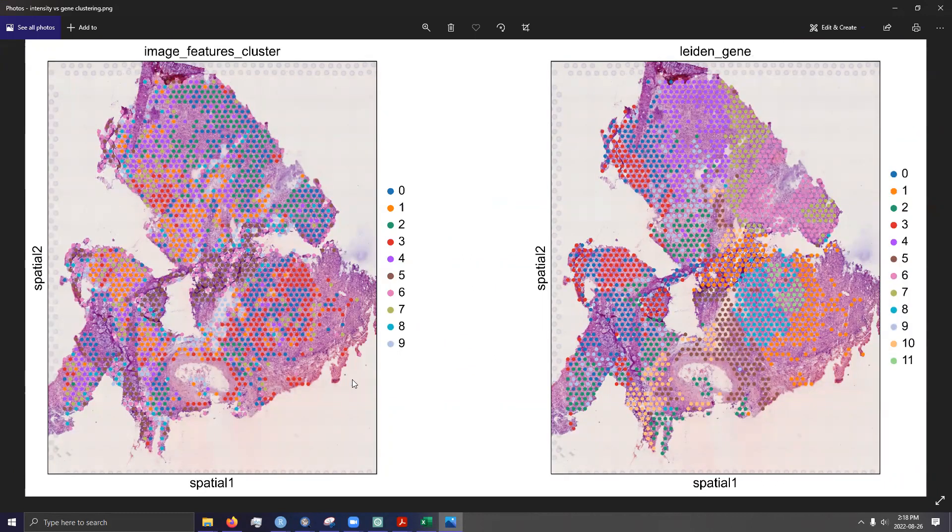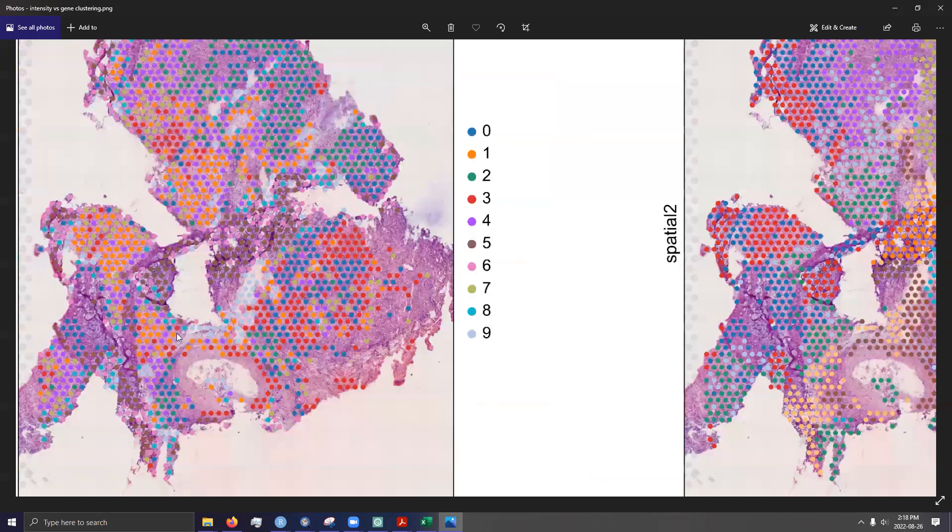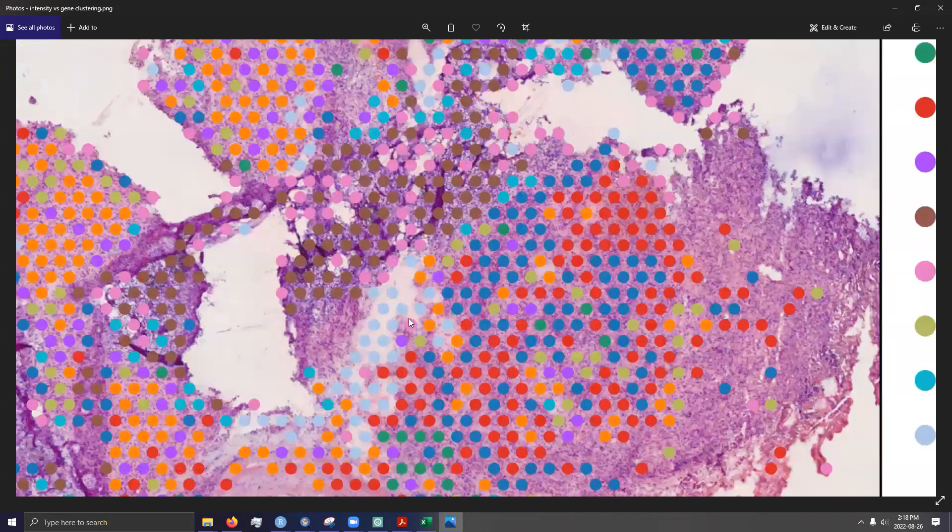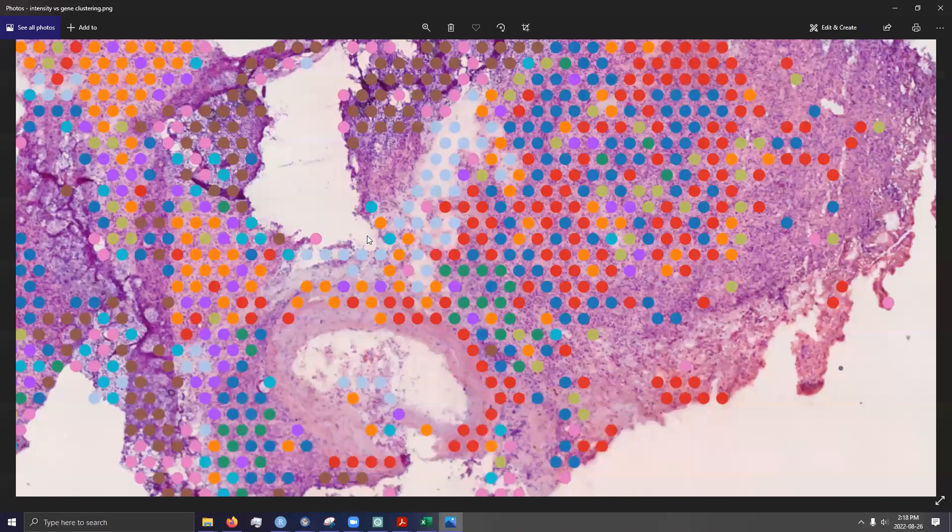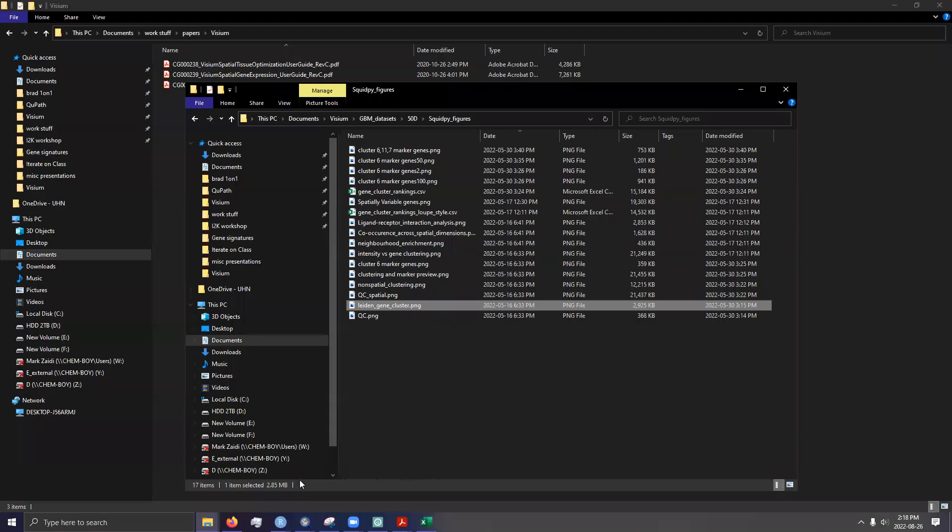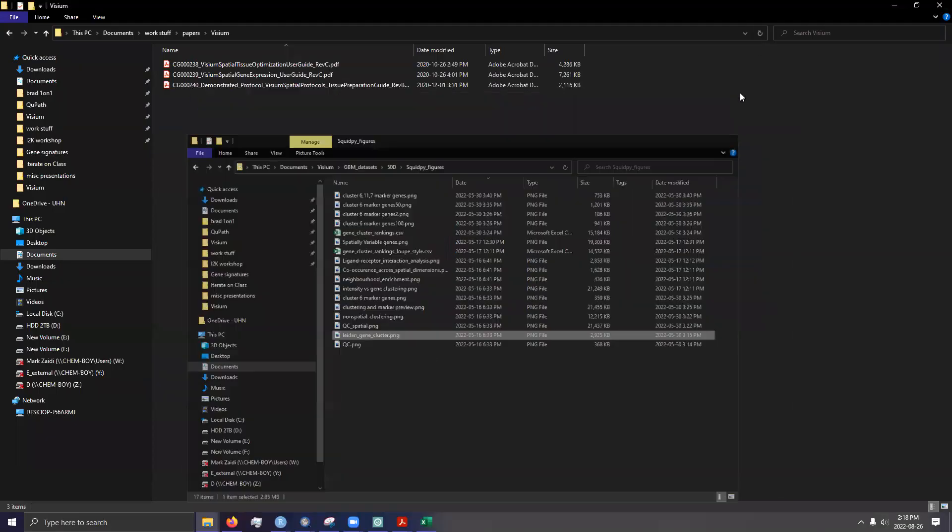Our tissue sections aren't the best. So as you can see, there are some features that simply correlate with tissue processing artifacts like folds or tears. But yeah.